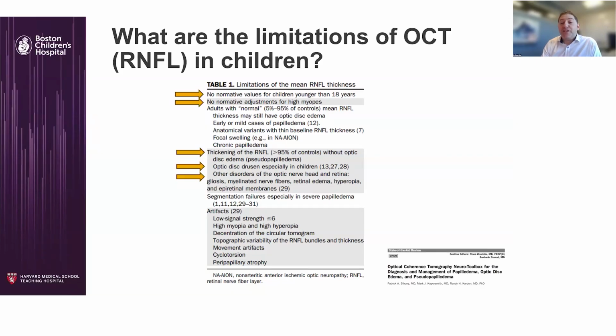And then, whenever I discharge a patient, especially one who had optic nerve swelling or papilledema in the past, I always tell them that when you see the next doctor, they may think your nerves look a little different, and that's okay. And I try to give them a copy of the photographs that I take, because gliotic nerves usually stay gliotic forever.